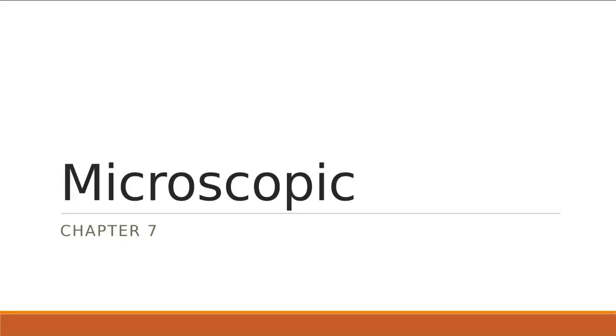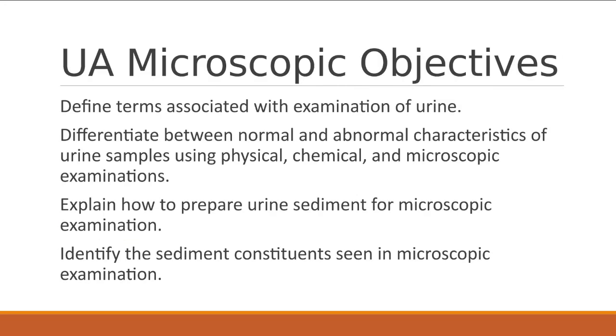Chapter 7, Microscopic. For microscopic evaluation, these are some objectives that you should have as a takeaway.